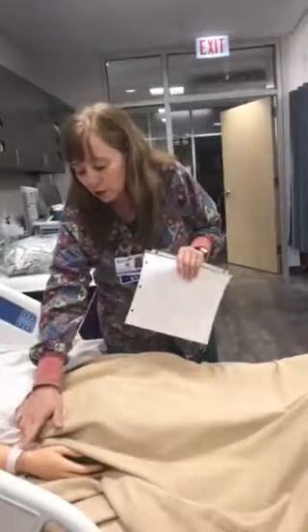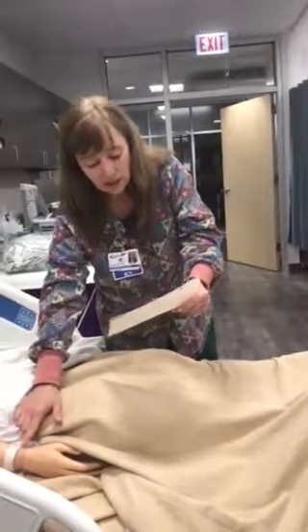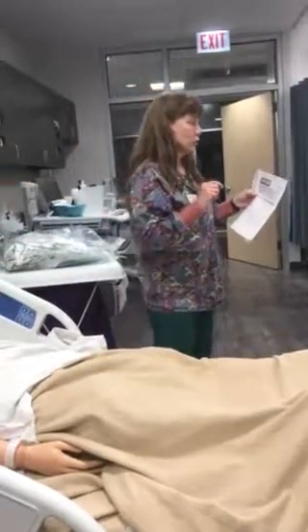Then what are you going to do? Check the patient's name, ask the patient for name and date of birth. My name is Chris. I'm going to be your nurse today. Can you tell me your name and your date of birth? Comparing it to the MAR, MRN 62188. Do you have any allergies to any medications? No, I do not. All right, so what is the next thing that we're going to do?